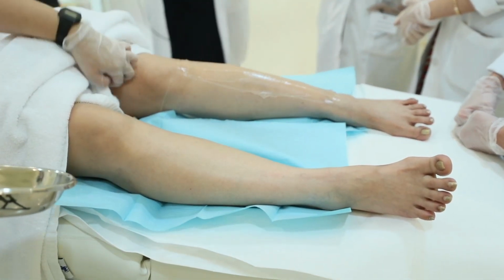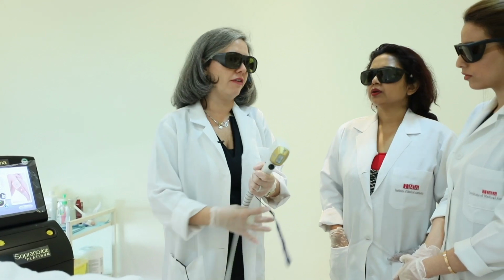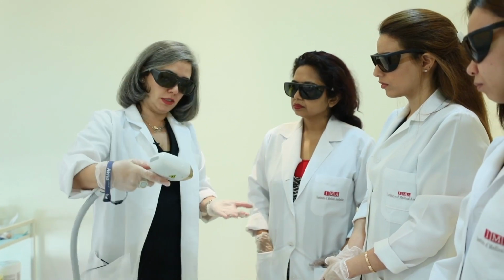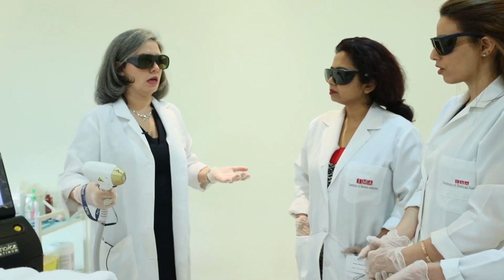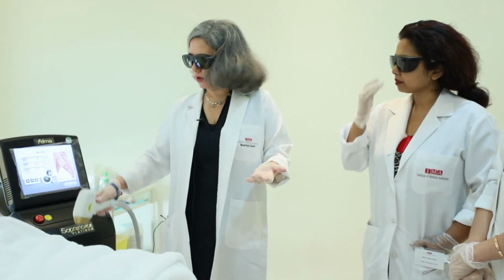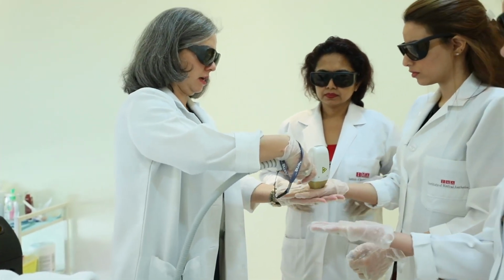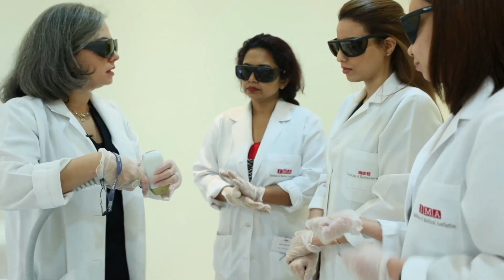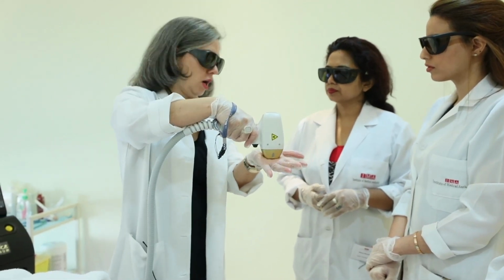What kind of cooling do we have in this device? This one is a contact cooling, a sapphire contact cooling, very effective cooling. What is your consideration when you have a contact cooling? As a safety part, how will I pick my laser? Never ever towards anybody's face or even towards the window. Whenever I pick a laser handpiece, I hold it towards the floor. I want you to touch the handpiece. Oh, it's very cold. Yeah. So this tells you your condition with contact cooling is always full contact.